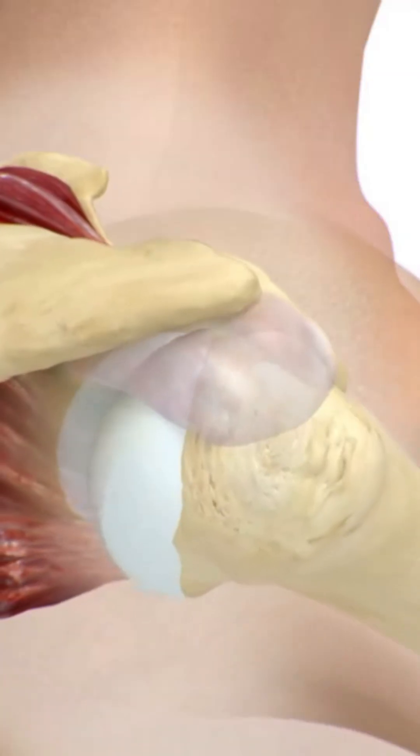1. Impingement Syndrome and Bursitis. In cases of impingement syndrome and bursitis, ultrasound can clearly observe the swelling of the bursa and fluid accumulation. Ultrasound images directly show the swelling of the bursa, allowing for accurate diagnosis and effective treatment planning. Additionally, precise injection therapy under ultrasound guidance enhances the accuracy and safety of the treatment.